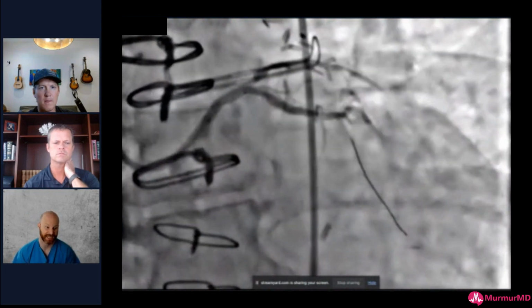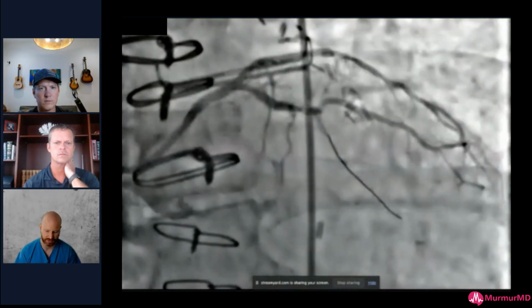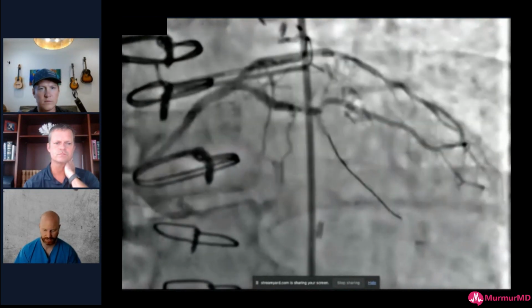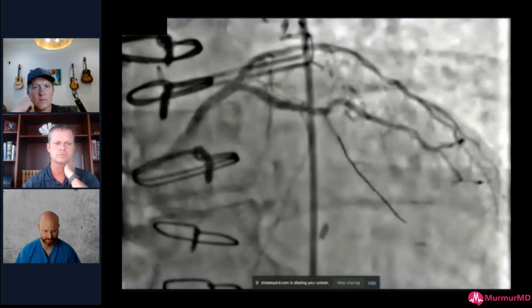And if you use a guide extension, I like to advance the guide extension back to the shockwave each time I want to move it. It acts sort of like a foot against a fence, as a little bit of a lever arm. It also kind of frees the balloon up, and you can move it in slightly smaller increments. These hydrophilic guide extensions are very soft and very unlikely to dissect, so they give you a little bit of protection from all those different things.